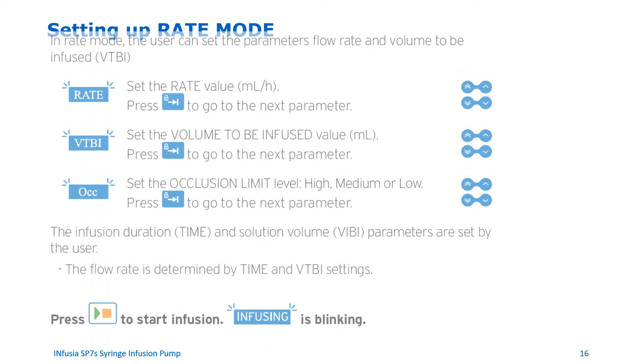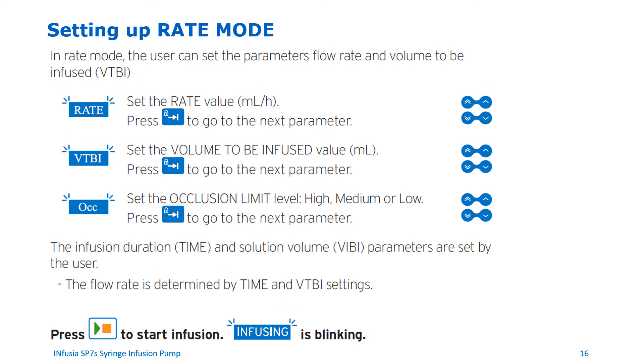Setting up rate mode. To set up rate mode, follow these steps. Set the rate value in mls per hour, then press the switch key to go to the next parameter. Set the volume to be infused value in mls, then press the switch key to go to the next parameter. Set the occlusion limit level to high, medium, or low, then press the switch key to go to the next parameter. You can set the infusion duration time and solution volume VTBI parameters, and the flow rate is determined from these parameters. Press the start key to start the infusion. The infusion indicator lights up and the word infusing will start blinking on the screen.